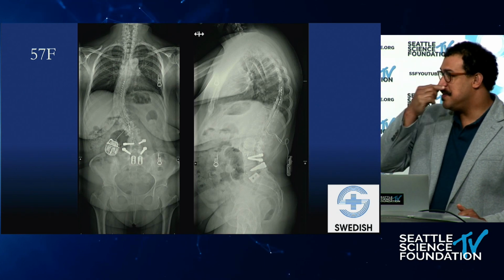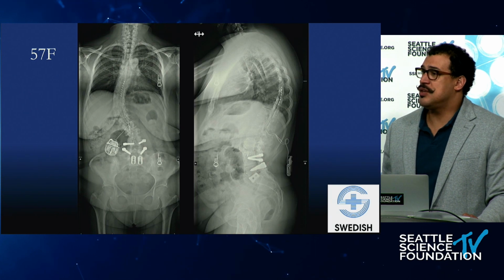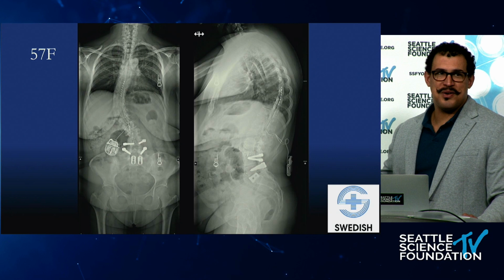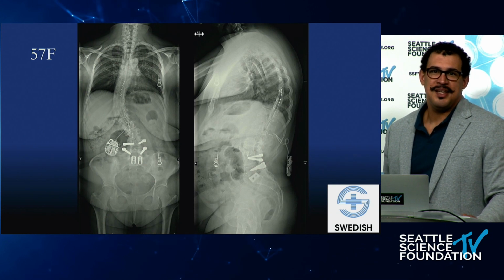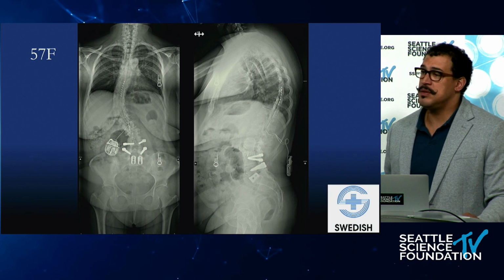Yeah, obviously this is, in the setting of deformity, I think it's probably a pretty strong contraindication. But is anybody seeing standalone laterals being done? I know it was kind of put out there at the beginning when lateral was coming out as something that was appropriate.